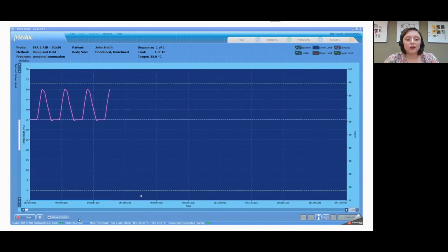It is important to be quite fast in this case, because to be able to induce phasic temporal summation, you need to maintain quite high frequency. You need to stay faster than 0.3 hertz, and this is possible due to 10 degrees per second up and 7 degrees per second down that we are applying here.